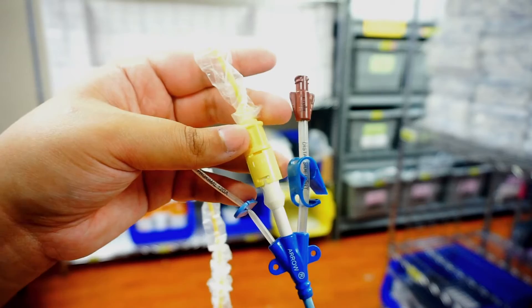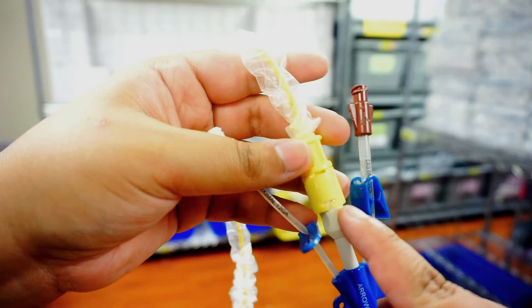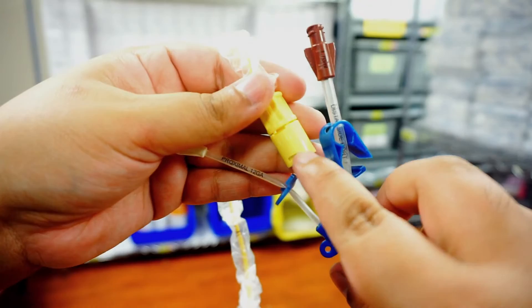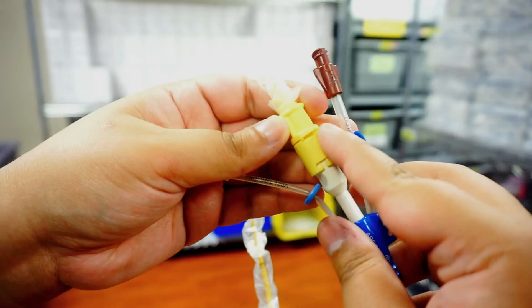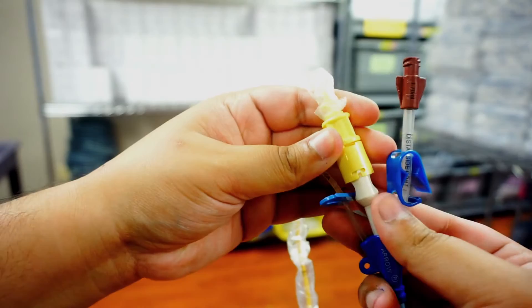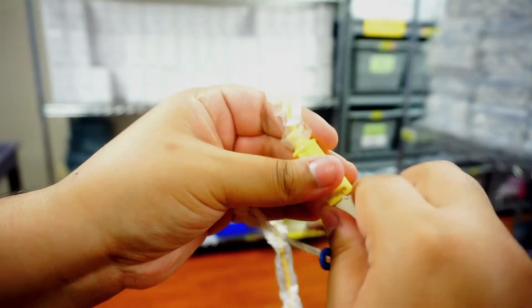So right now, what's keeping my Swan from being pulled out is this little divot that we have locked in place. If I was going to DC my Swan and I wanted to keep my cordis, what I would do is I'm going to move that divot to the center and then I could pull this whole thing out and leave the cordis in.